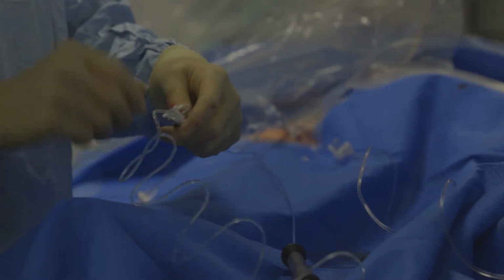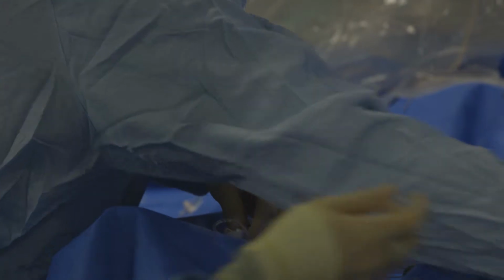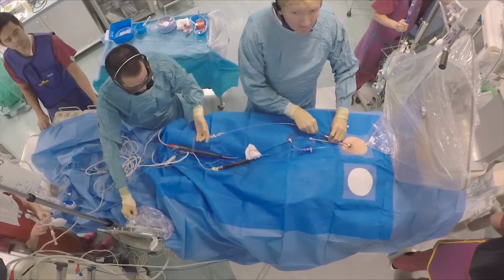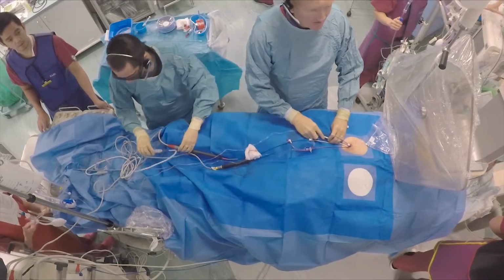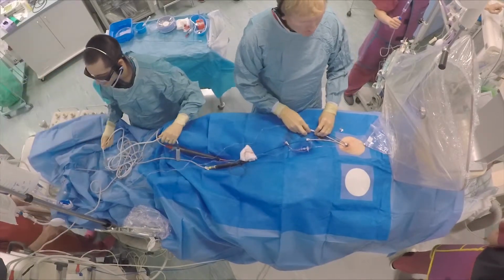As I've said earlier, we do this under transesophageal echocardiographic guidance. This minimises fluoroscopy, and in this case we use 47 seconds of fluoroscopy for the entire case. Normally the fluoroscopy time is less than a minute for all cases.